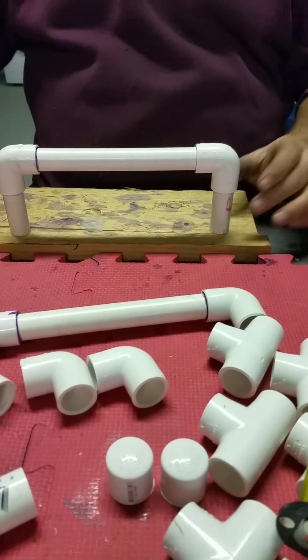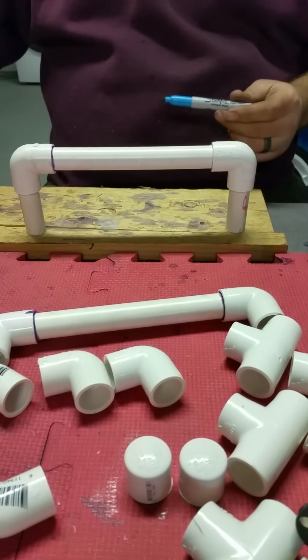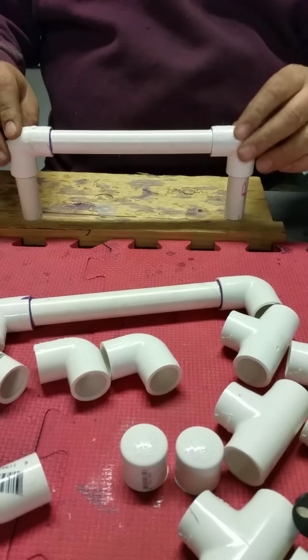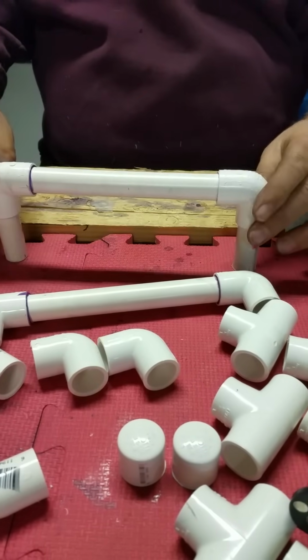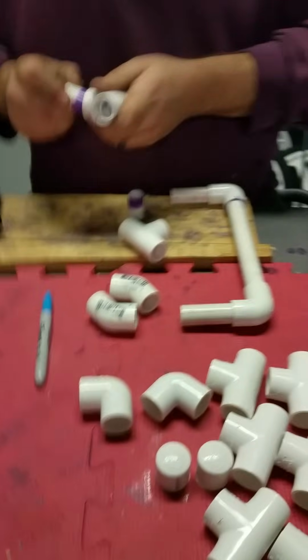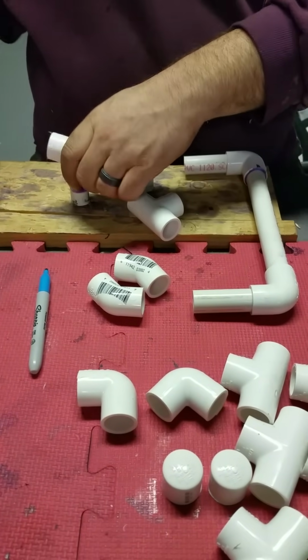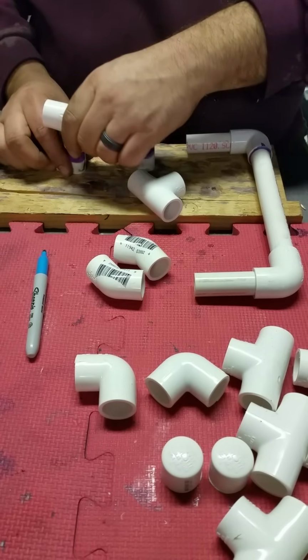And here again, it's important to make sure that it still stands straight and is not wobbly, that you have both legs inserted the same amount. Okay, so now we're putting together what's going to be the legs.